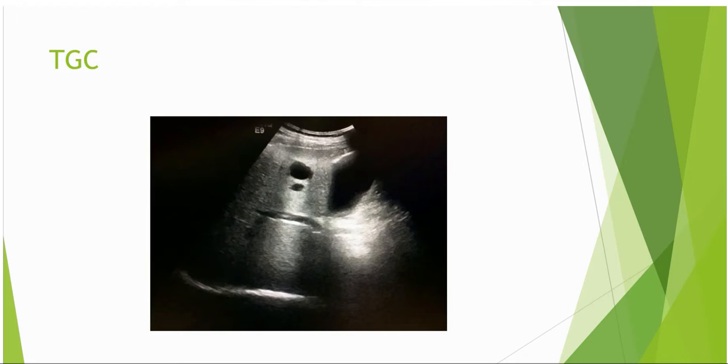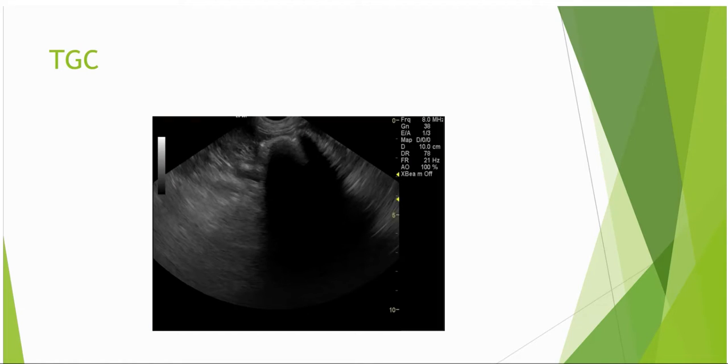If waves travel through a fluid-filled structure, such as a cyst, then echoes beyond the structure may be displayed as brighter. This is also known as enhancement artifact. In this instance, the TGC beyond the interface change may need to be brought back in order to obtain uniform brightness on the screen. Conversely, we could image through a dense tumour that may highly attenuate and lead to shadowing artifact beyond the structure. In this instance, the sliders need to be pushed rightwards to increase the gain beyond.